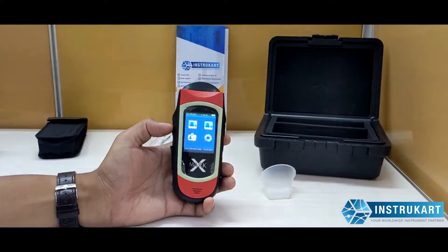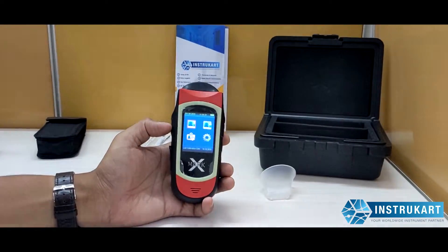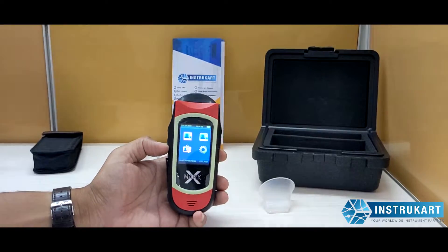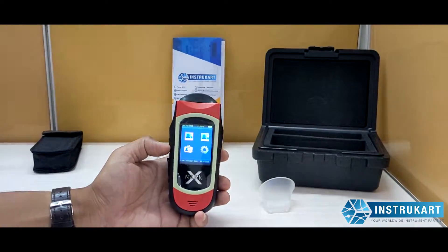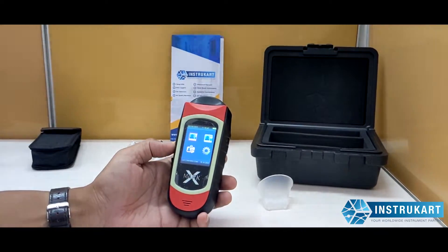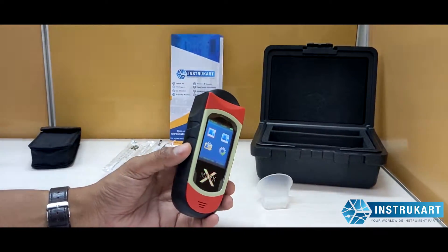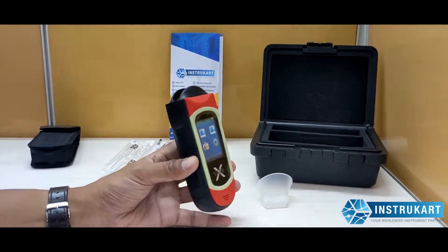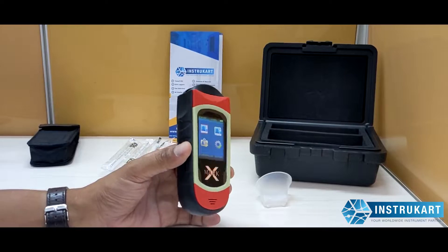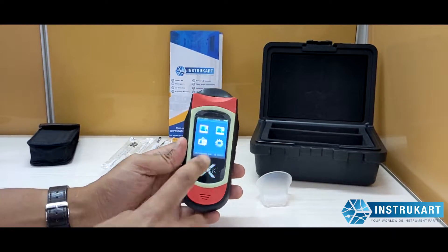This device uses a fuel cell sensor. It has a working temperature range of minus 10 to 50 degrees Celsius and a storage temperature of minus 20 to 70 degrees Celsius. It also has a storage humidity of not greater than 95 percent.